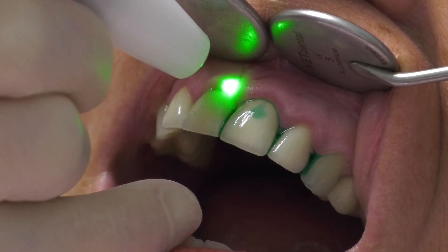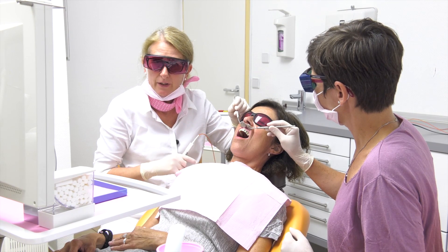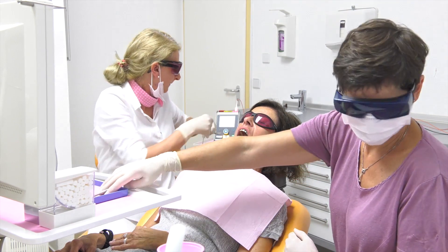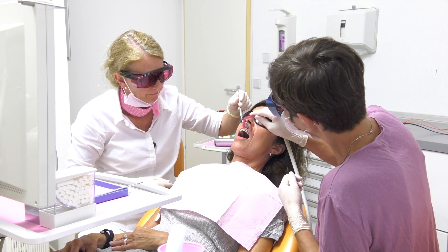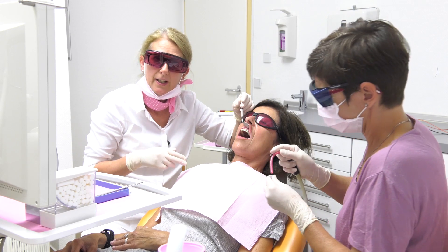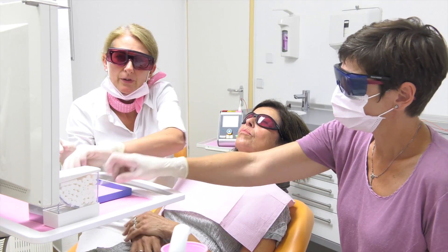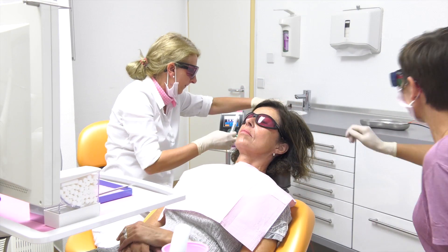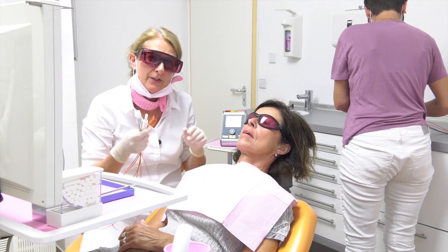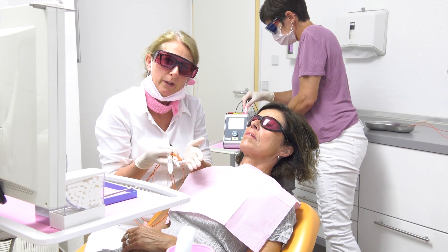We do not have any contact with the surface of the gingiva. Now we take off the old dye, and we also take off the saliva ejector. Now before I put on fresh dye, we have to change our fibre. This is the transgingiva fibre — I think you have already seen it in one of the videos before.